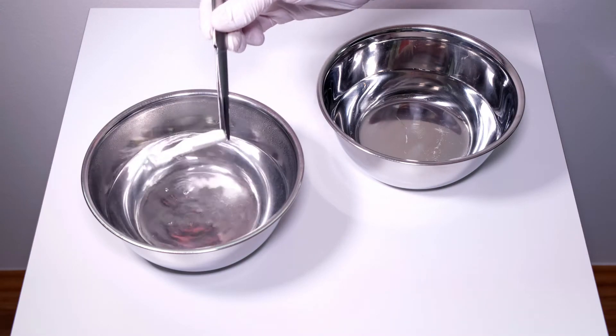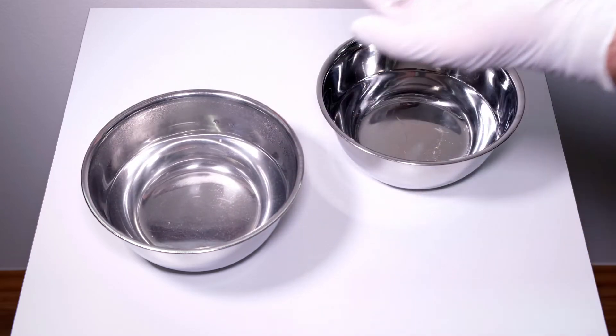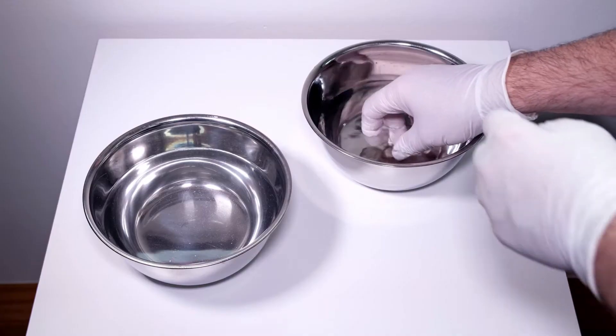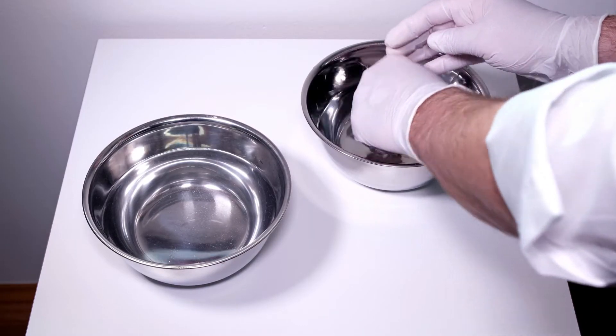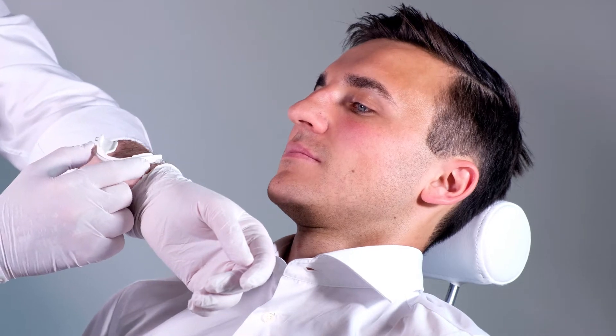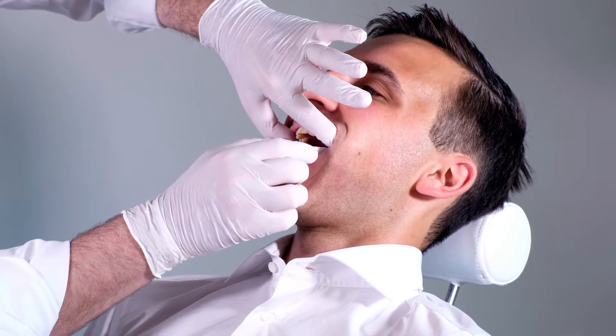Using the tweezers to grab one of the fixation knobs, take the tray out of the water. Allow it to cool down in the air for about 60 seconds while carefully shaking off excess water. Moisten your gloves with water to prevent them from sticking to the appliance. Make sure that the material doesn't cause burns when inserted into the mouth.